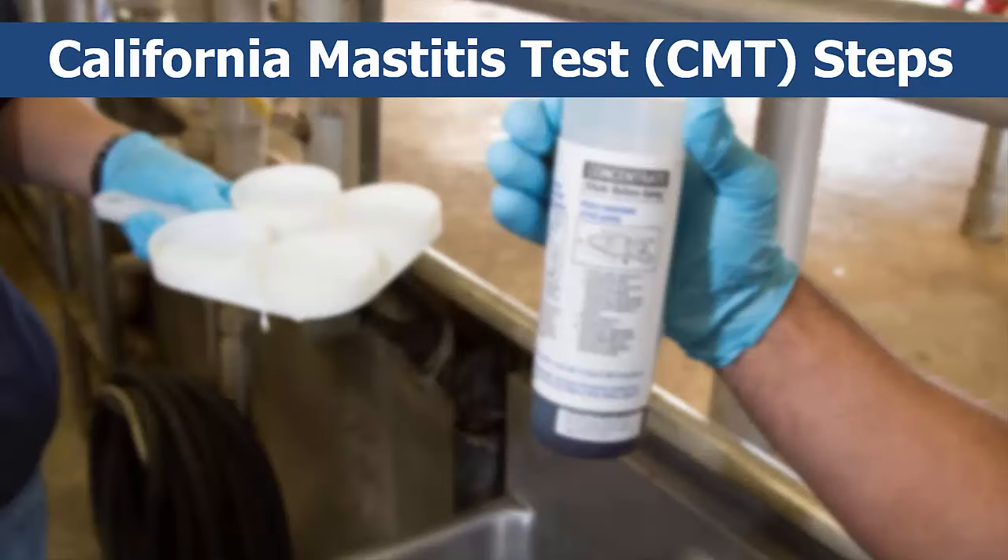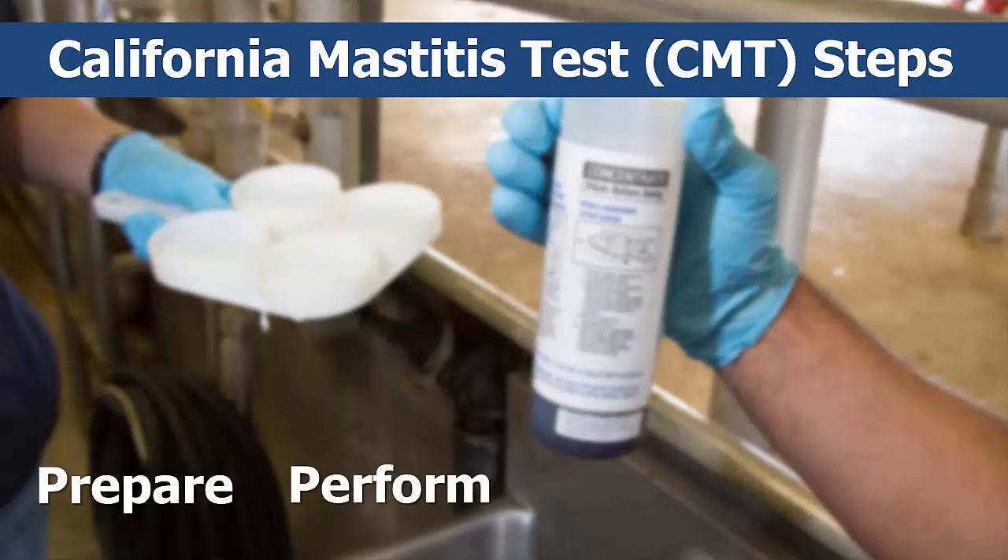The CMT involves a few simple steps. The first step is to prepare for the test itself. The next part is to perform the test, which involves three steps: putting milk in the paddle cups, putting CMT solution in with it, and then swirling it gently to mix. Quickly following that is reading the results, and finally you will need to interpret the results.